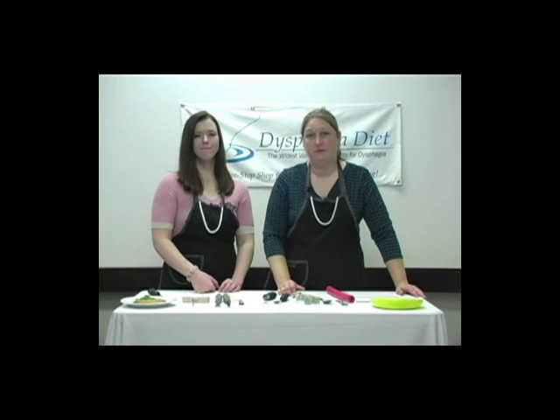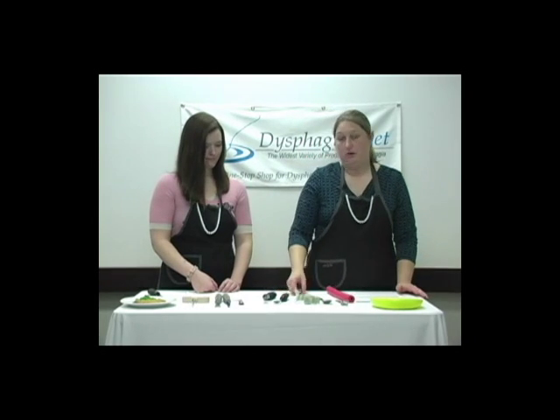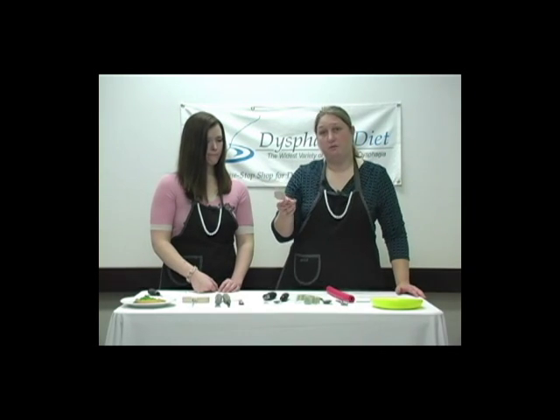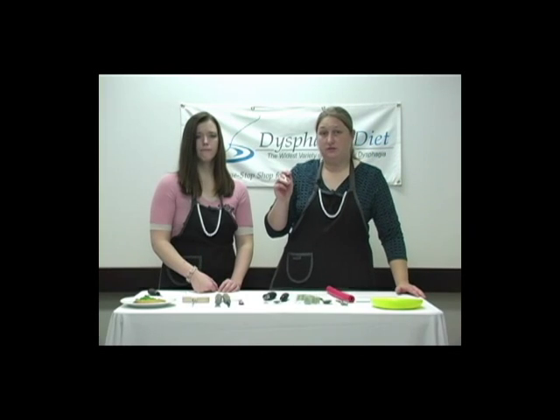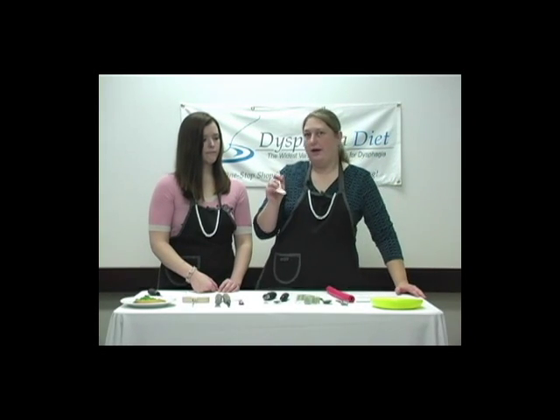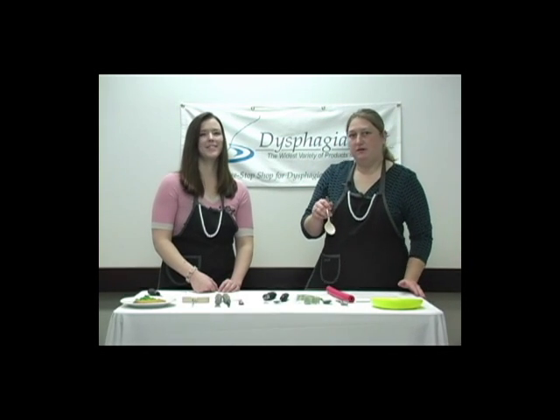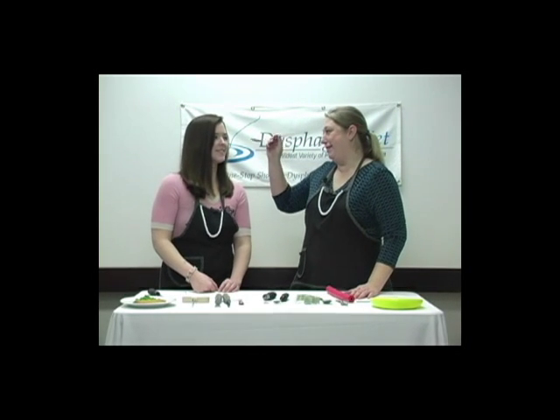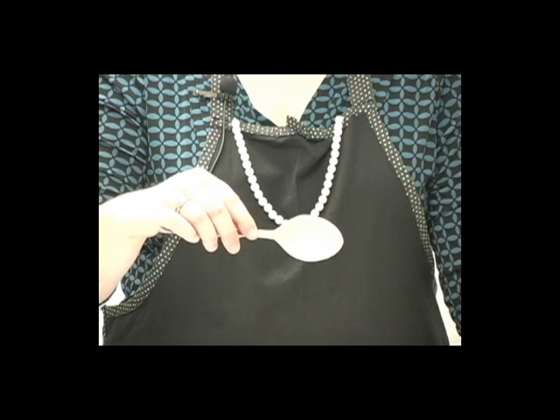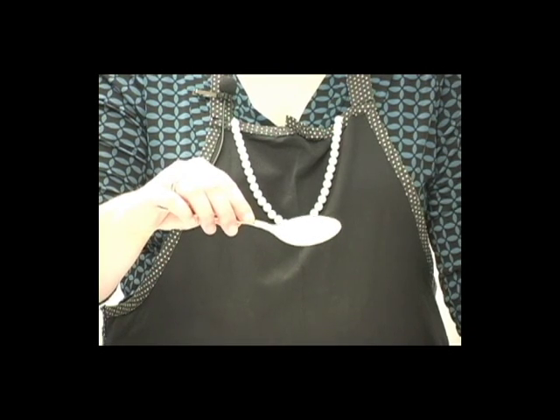The final item I want to show you in this group are the coated spoons. They have three great uses. One is they're easy on the lips for someone being spoon-fed. One is they're good for people that are sensitive to temperatures as well. And the last thing they're good for is if someone has a really hard bite down, as Cassie showed. That way, your teeth have a soft landing.